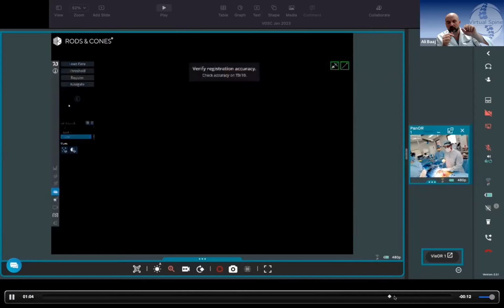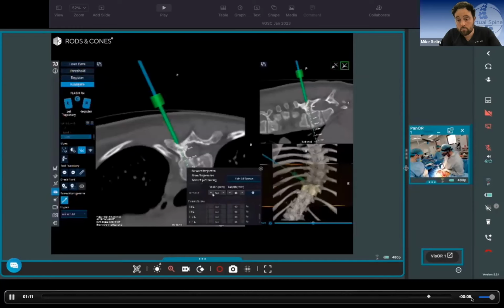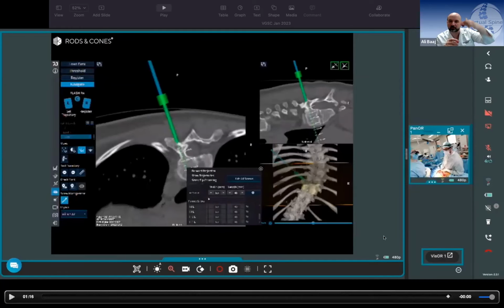So each time you're cannulating T7, T8, T9, whatever it is, what's your plan here, Kieran? Are you registering 1 or 2 or 3 segments at a time, and then restarting that process for the next 2 or 3 segments? Yeah, that was a 2-segment registration there because the anatomy was a bit tricky, and you were coming around the corner. One of the challenges is that if the spine is very curved or kyphotic, as you come over the corner, all systems do struggle with the clamp relative to that. So I register 2 to 3 segments as standard.